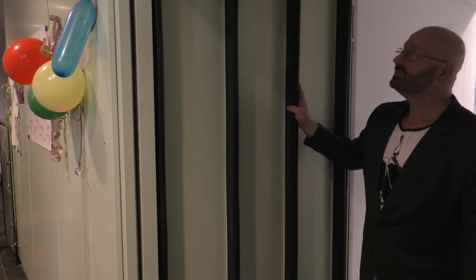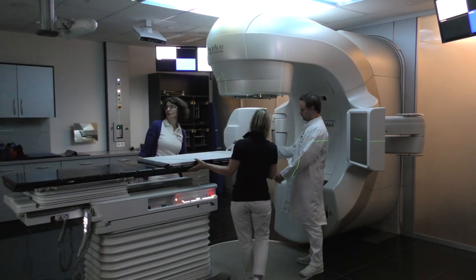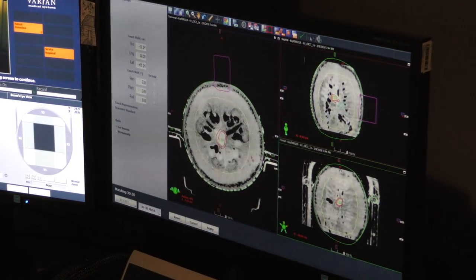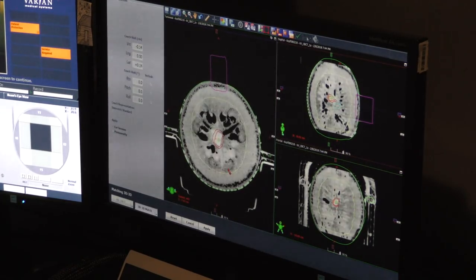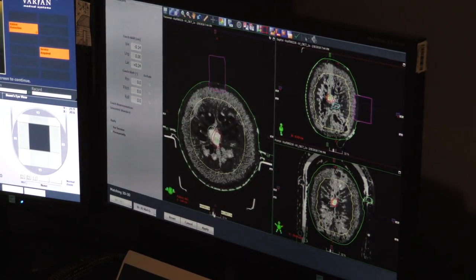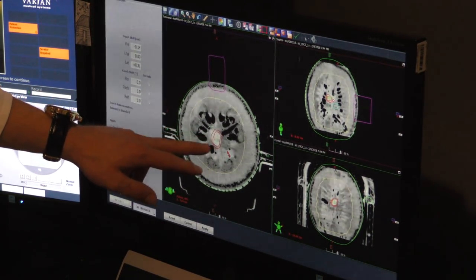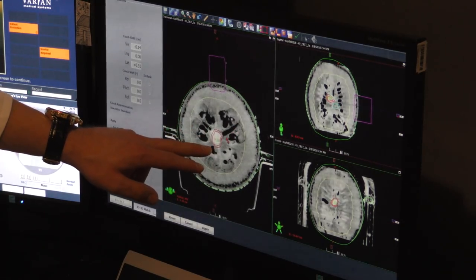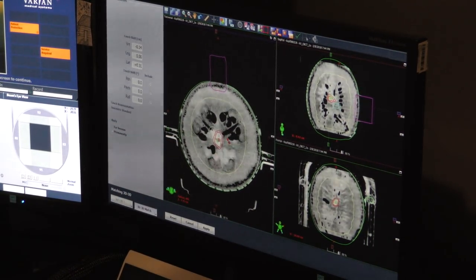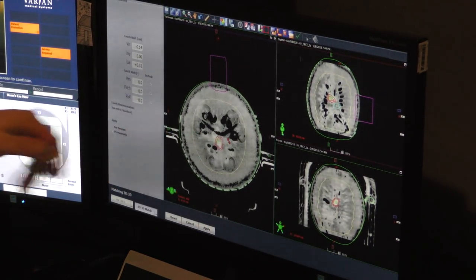Now we can compare the original CT scan with the CT scan taken inside the machine, and we can see that the position is very much exactly the same — confirming the exact position of the target we have defined.